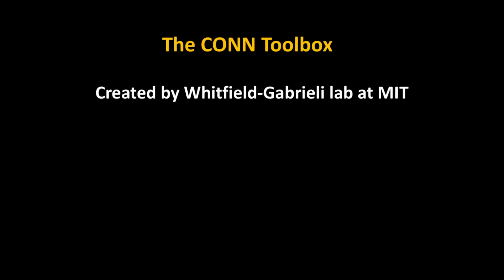This CONN toolbox, well, let me explain. Part of my job is to identify toolboxes and programs which may be useful. And to do that, I need to know which ones have staying power, right? Which ones are going to hang around for a while. You may have run into this at some point.